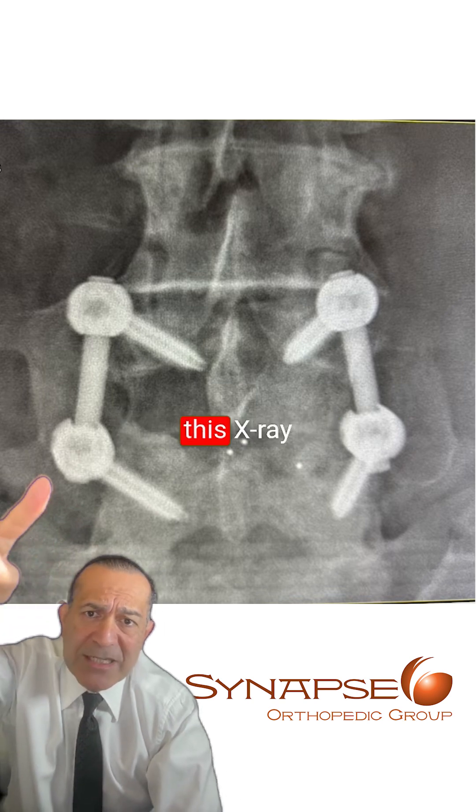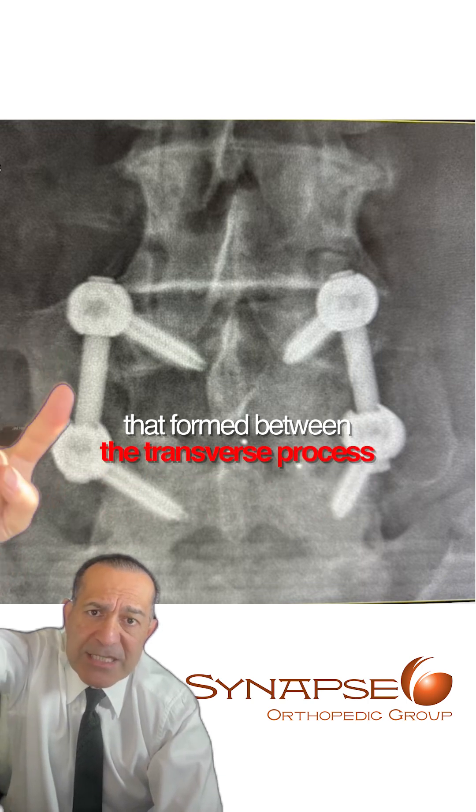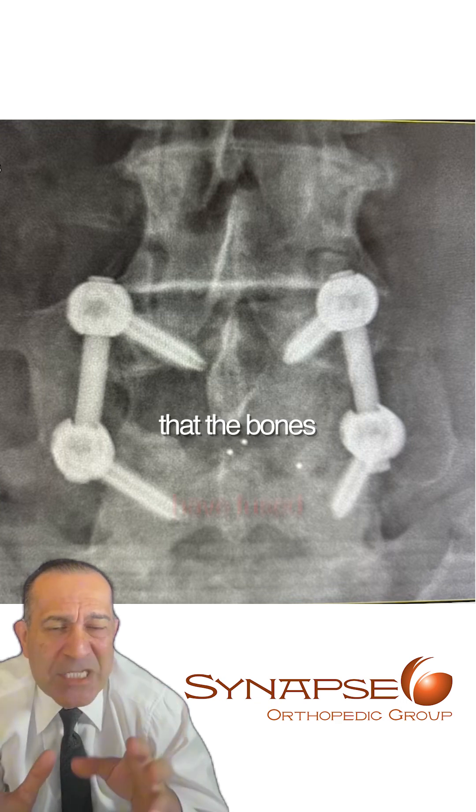Now, what's important on this x-ray is this bridging bone that formed between the transverse processes. And once we see this bridging bone, we can be relatively secure that the bones have fused.